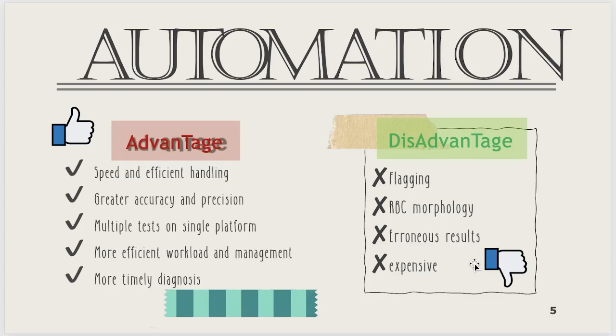Kumbaga, if we buy the reagents from that particular company, then they will allow us to borrow their machine. Pero, kailangan dun kami bibili ng reagents for that particular na machine. So, kumbaga, naka-tie up or may kontrata kami. So, kasi it's very expensive. The machine is very expensive. Millions. That's why usually naka-tie up or kontrata lang yan and bibili lang kami ng mga reagents sa kanila. So, pinapahiram lang kami na kanilang mga machines.